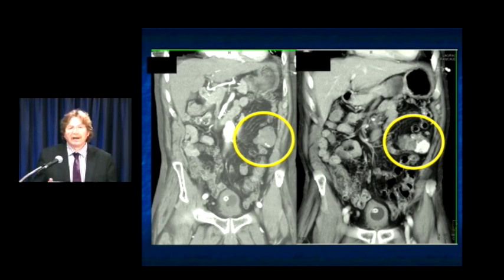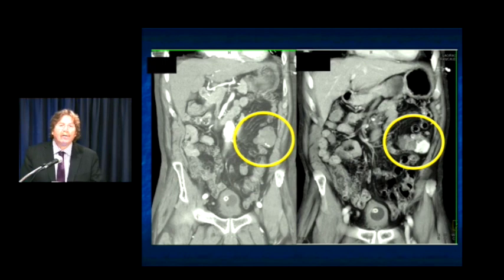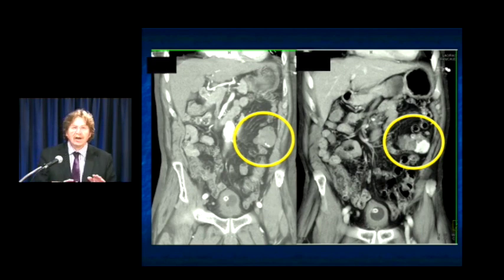Some people do non-contrast scans first. They're concerned about the possibility of high-density matter in the bowel simulating a bleed. What we did, in order to minimize the dose, is we got rid of the non-contrast and we do arterial and venous. Most people were doing non-contrast and arterial. By doing arterial and venous, you have the advantage of having that venous for detecting late bleeds. Also, in my experience, if there's a bleed present, it always changes between arterial and venous, more or less, but it will surely change.